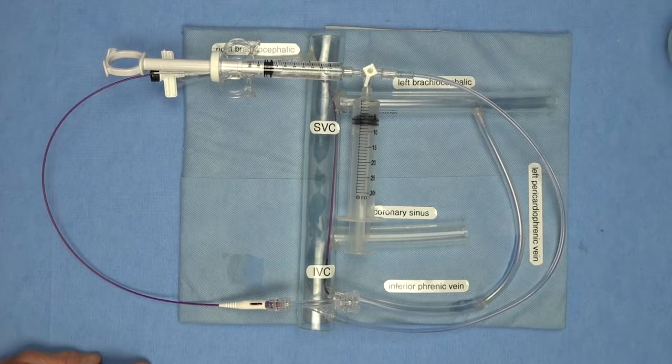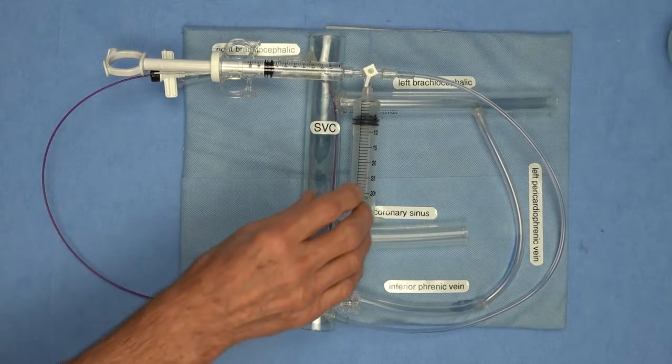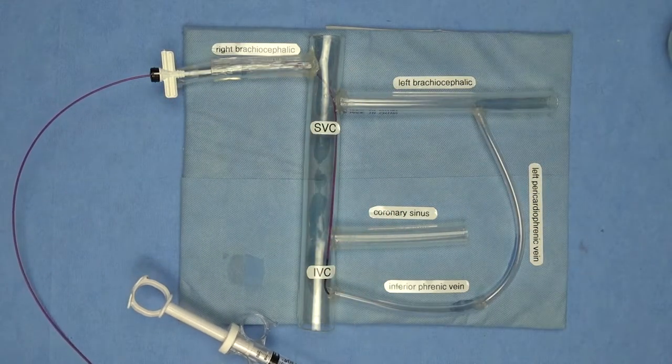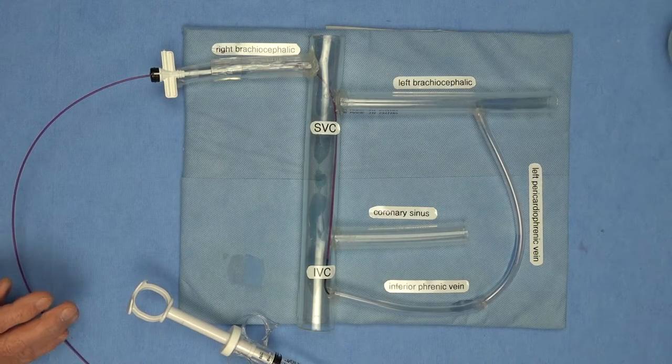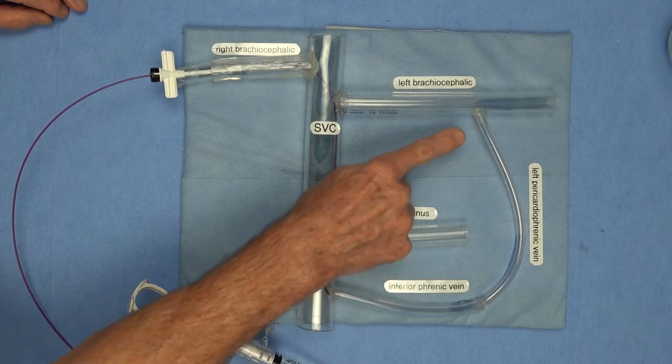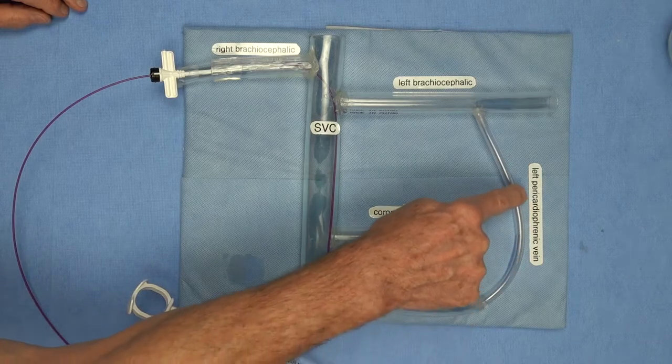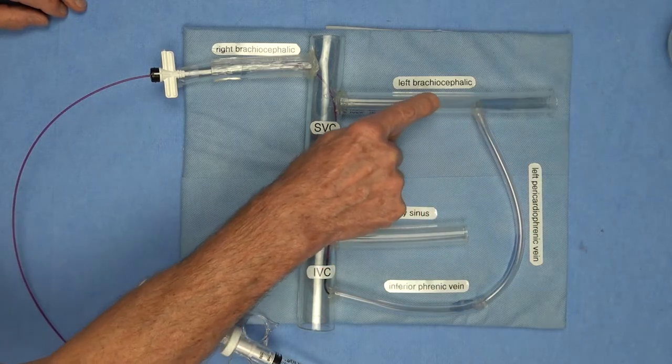Those of you who are beginning on the respicardia implant adventure, here's a couple more tips. One of them is if you can't find where the left pericardiophrenic vein enters the left brachiocephalic vein.